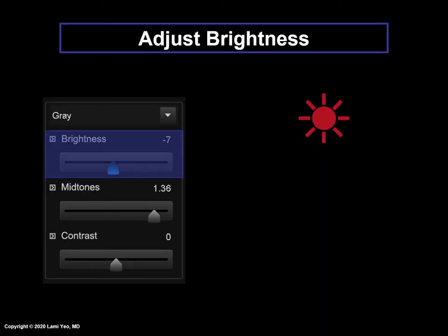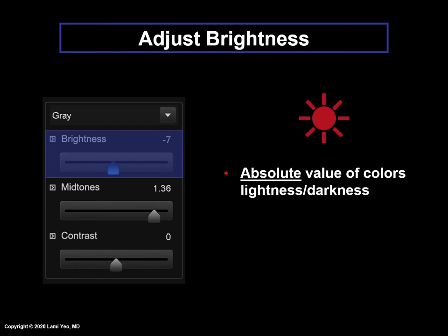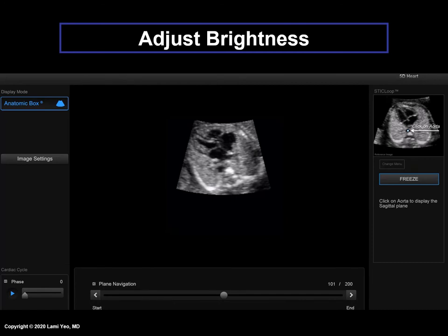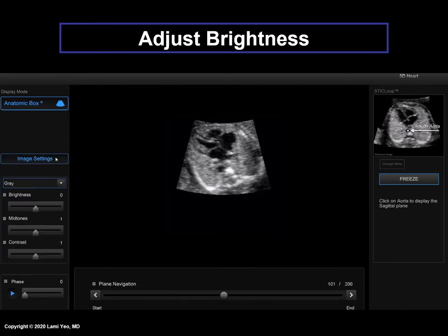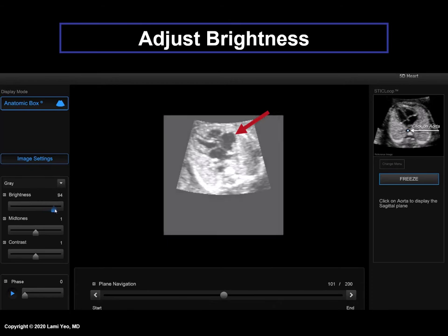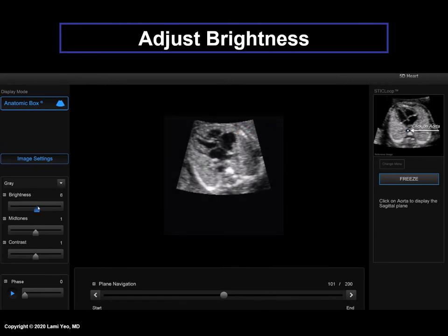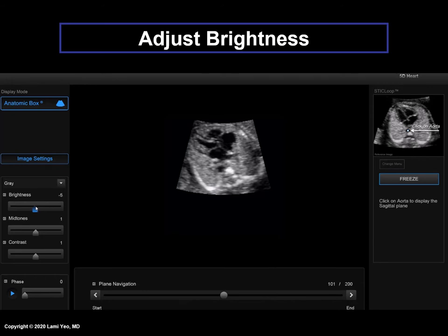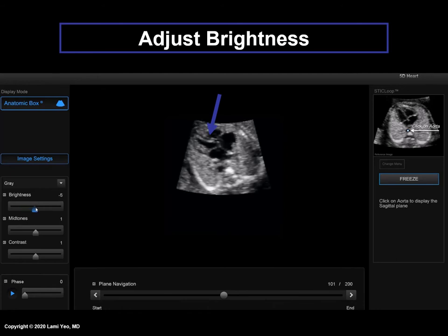Brightness refers to the absolute value of colors — lightness and darkness. For the fetal heart, adjusting the brightness affects the appearance of the blood pool. If increased, there are more speckles in the blood pool of the cardiac chambers. If decreased, the cardiac chambers become very dark. However, if brightness is decreased too much, one can falsely create septal defects, such as in the ventricular septum. Therefore, be careful with adjusting the brightness.